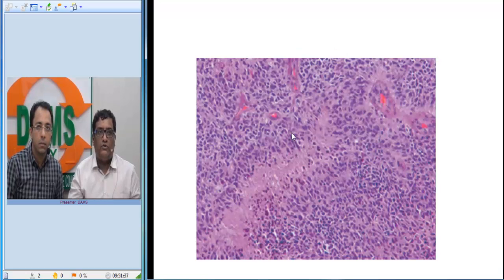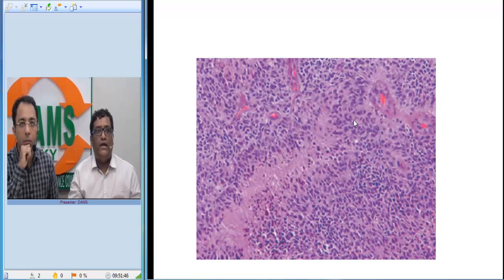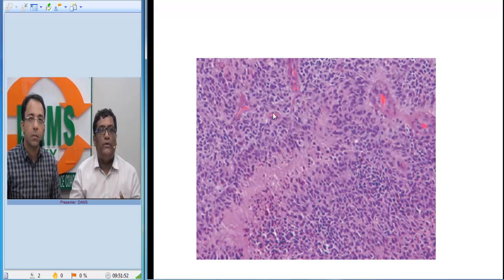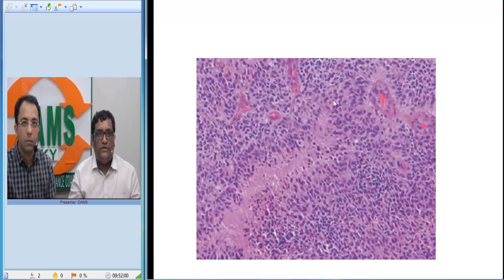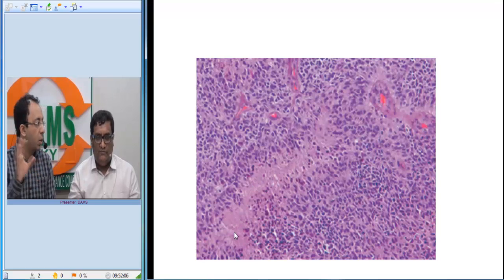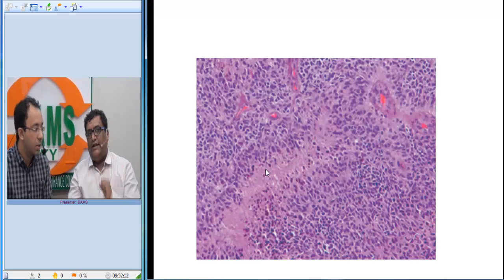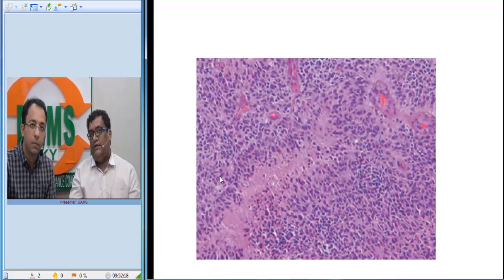On microscopic examination, there is high cellularity, and increased cellularity tells us the tumor is more likely aggressive. On high power, we see mitosis as well. In the center, there is necrosis — this is the counterpart of the necrotic areas seen on the MRI. The non-enhancing areas correspond to necrosis, surrounded immediately by enhancing areas due to vascular proliferation and the many vessels present.